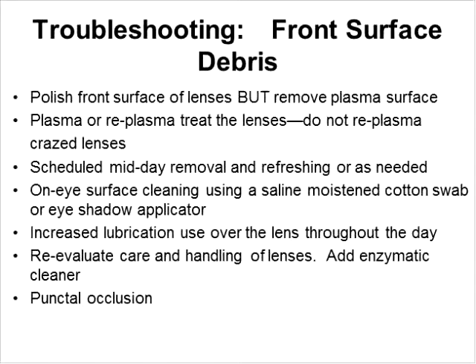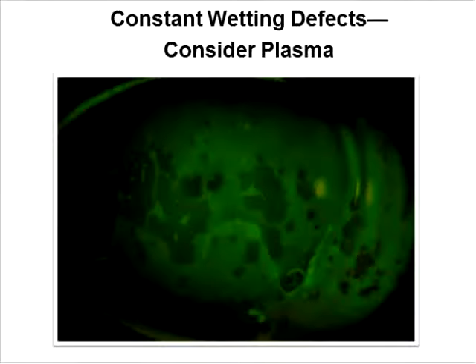We recommend increased lubrication of the lens throughout the day, so artificial tear use. And you want to also reevaluate the care and handling of the lenses, remove any potential sources of preservatives that they could react to, consider adding enzymatic cleaner, and also punctal occlusion.